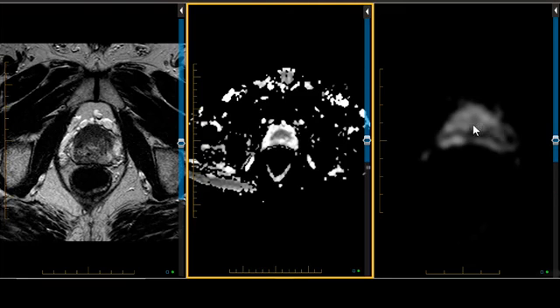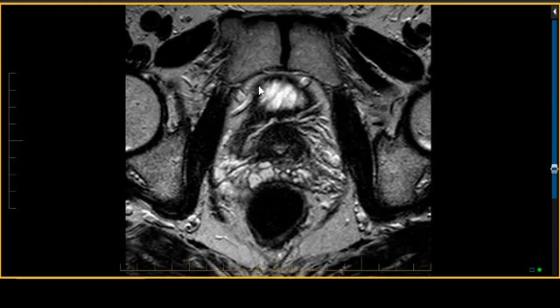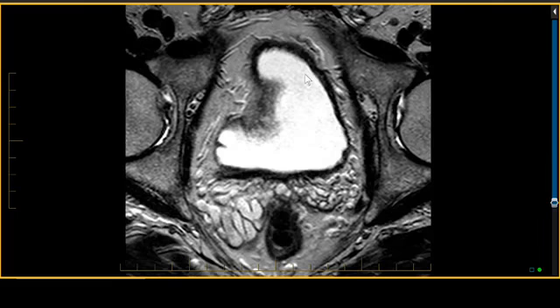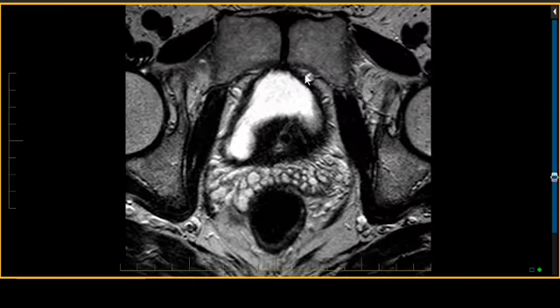diffusion weighted image. Now let's go back to the morphologic image for a moment, and let's make a survey. Now some of you may like to have a T1 weighted image, or a 3D T1 image, such as a T1 GRE with thin slices, to look for nodes and separate them out from vessels, and look for bony metastases and other morphologic abnormalities, and that's perfectly reasonable. You could also use a high-quality T2 to do that, although it's not as easy.